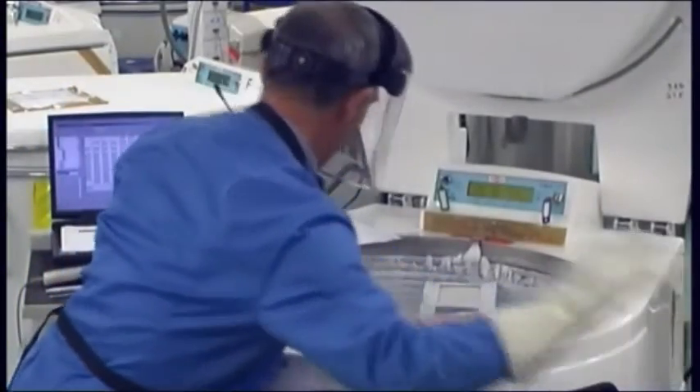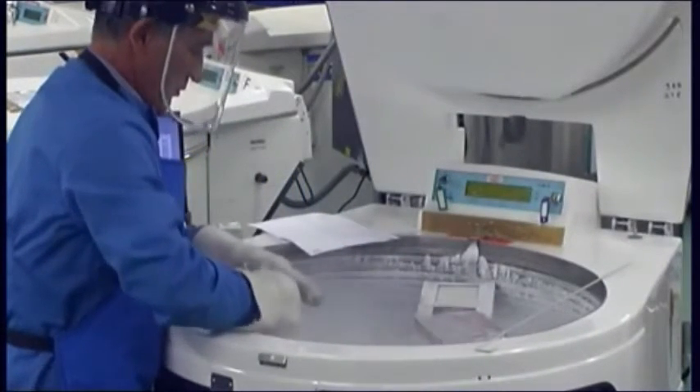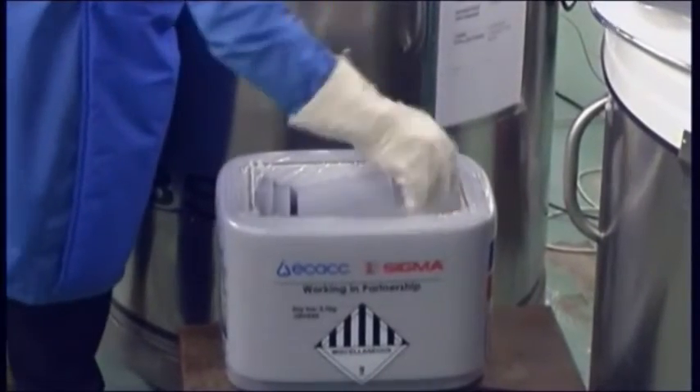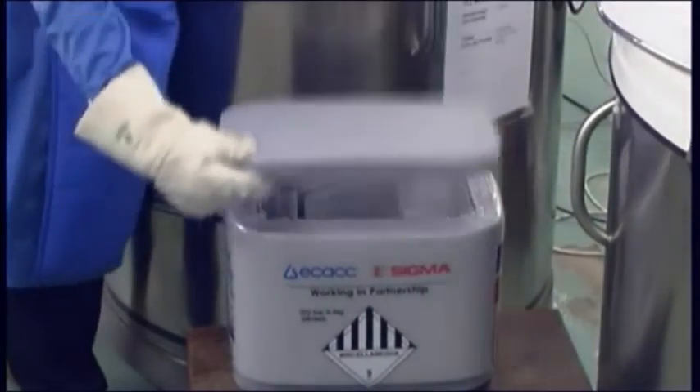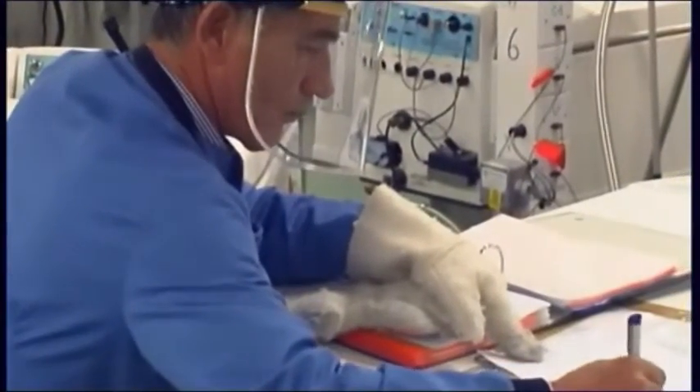Having put on the correct PPE, collect an ampoule of cells from the liquid nitrogen storage and transfer to the laboratory in a container of liquid nitrogen or on dry ice. Always record the removal details in the cell bank records.